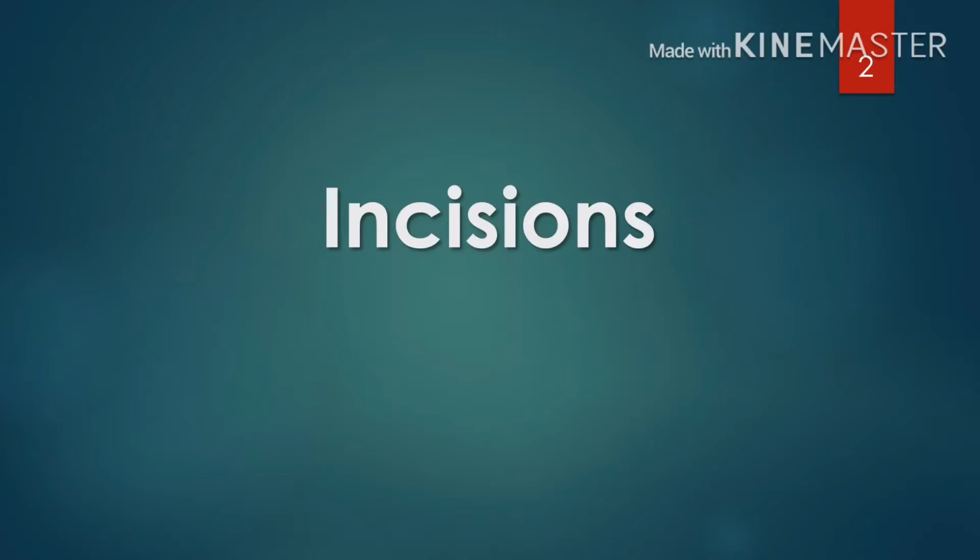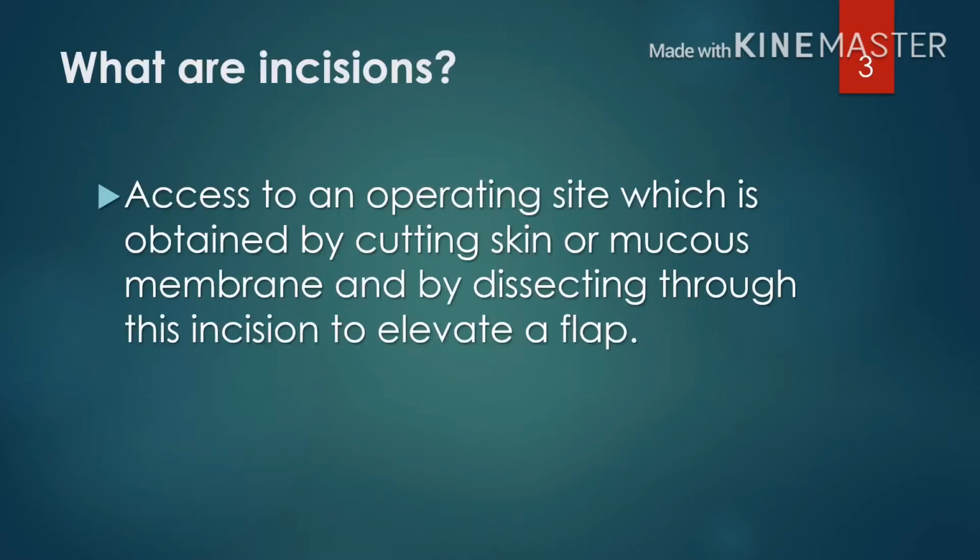The first topic here is incisions. So what are incisions? Incisions are a way to get access to an operating site, which is obtained by cutting skin or mucous membrane, and by dissecting through this incision to elevate a flap.